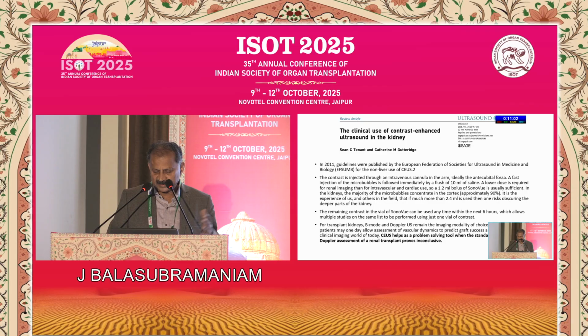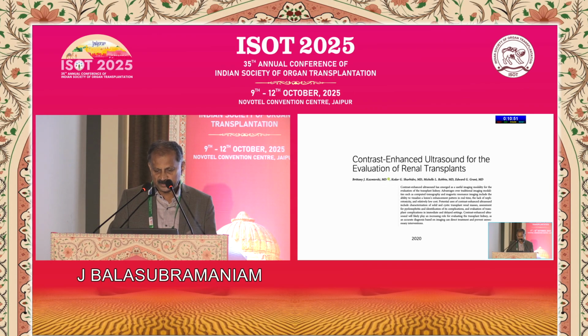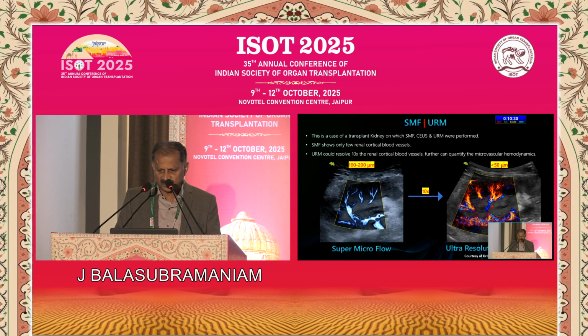But again, see, there has been talk about this contrast enhanced ultrasound for quite some time. Some of these papers are 5-10 years old, and they were given good impressions only, but somehow it is not being taken up and studied further because of limitation of the machine availability and cost of the contrast. And again, this has to be done by nephrologists. I'm sure radiologists are not going to be interested in this, spending time and looking for newer measuring tools and all those stuff. So some of us, preferably younger ones.